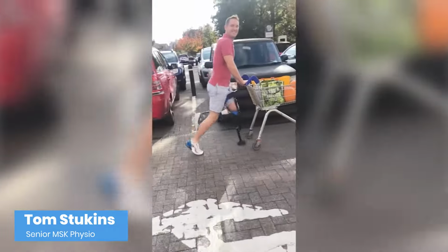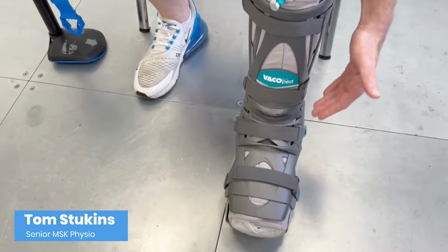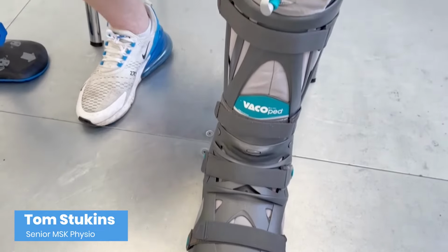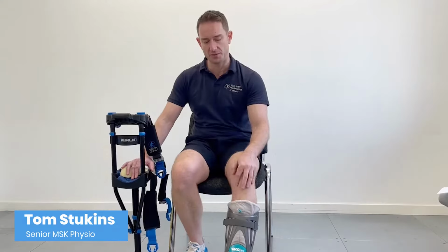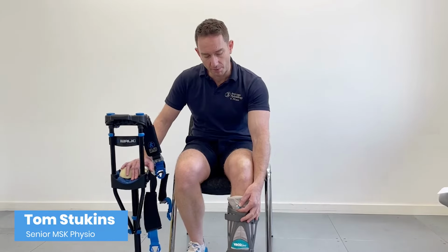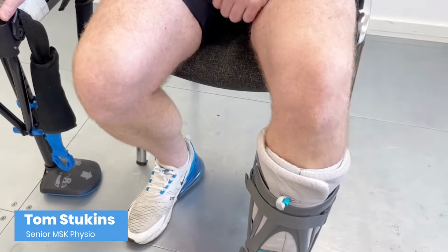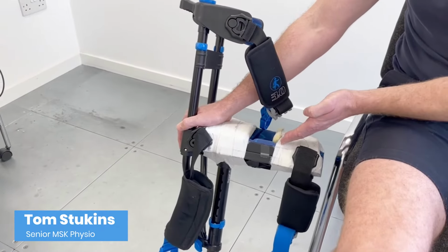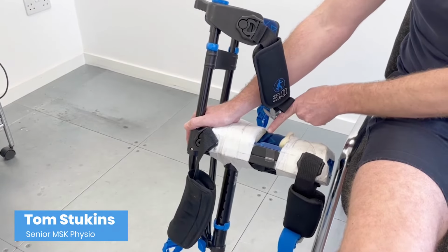Using the iWALK in the plaster cast was very straightforward and very simple, and had even pressure distribution across the whole calf and shin. But in the vacoped, which is now the gold standard treatment for the management of Achilles ruptures, the slight problem occurred with the valve being placed on the front of the shin, meaning that the pressure going through the pad on the iWALK3 was unworkable.